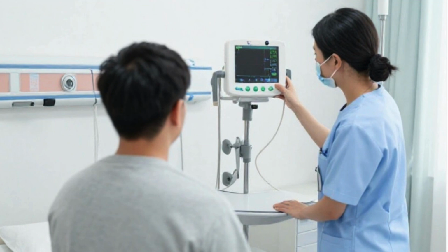5. What is the primary function of sensors in a patient monitoring system? A. To store patient data. B. To detect physiological signals. C. To analyze medical images. D. To display numerical values. 6. Why is correct sensor placement important? A. To increase battery life. B. To reduce alarm volume. C. To ensure accurate readings. D. To improve network speed.